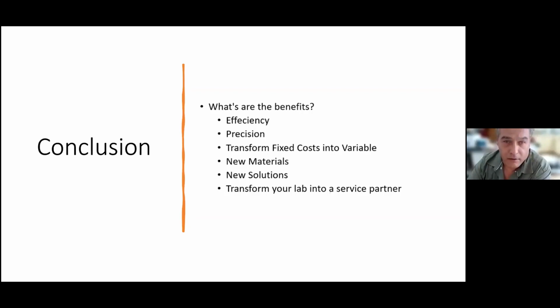A liner, if you do clear liner, you also can do the same. You can do a planning digitally, and then you send this to your client, look at my design, can you confirm it? Or you print the final setup of your teeth and show it to the patient. Hey, this is what you get.